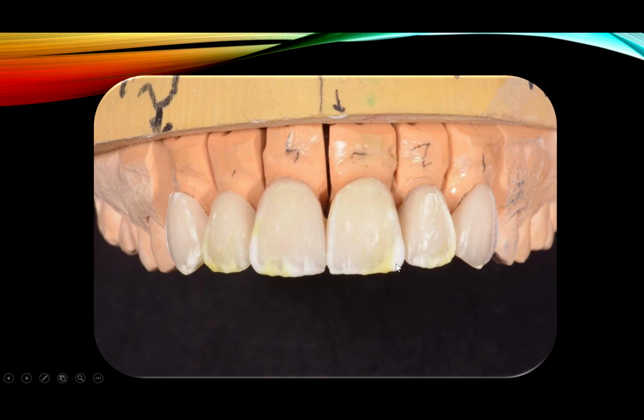And of course I did cut back here, but you can't see it because I should have taken a photo of the cutback. All right, and I micro layer, sometimes I do it one time. Once I bake this, it's done. I glaze it, and sometimes I micro layer again. This was the second time, but I want you to imagine that the first time wasn't much more than this. Actually, maybe it was less. Or maybe this was the first time, but anyway, it's micro layering.